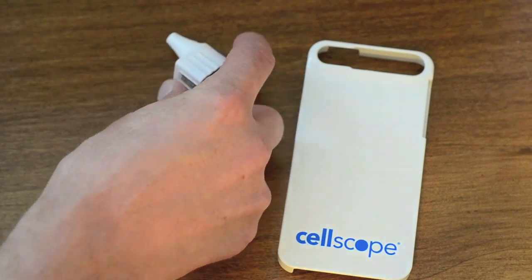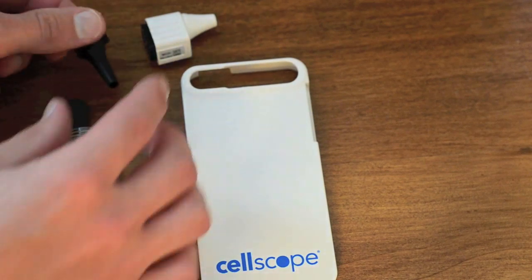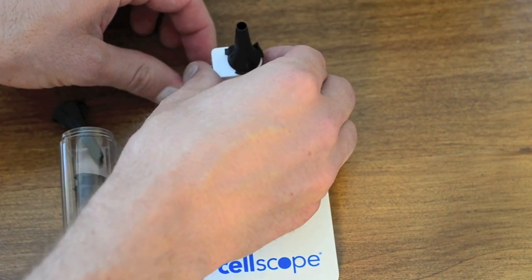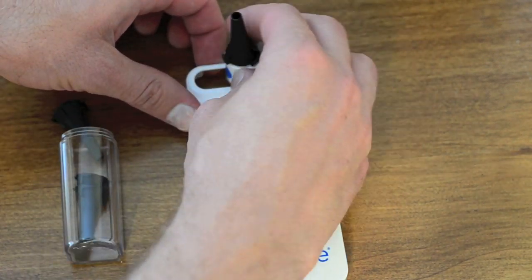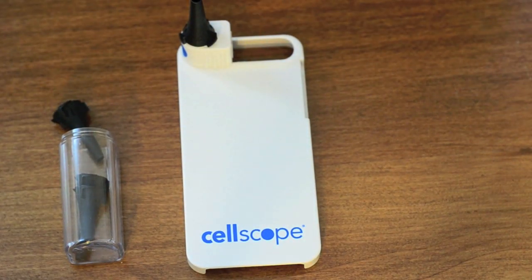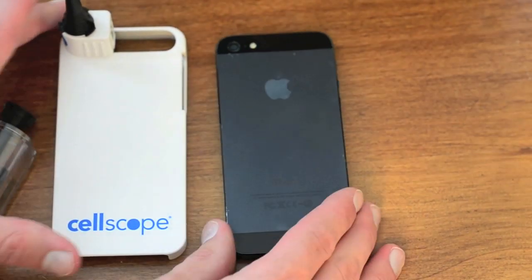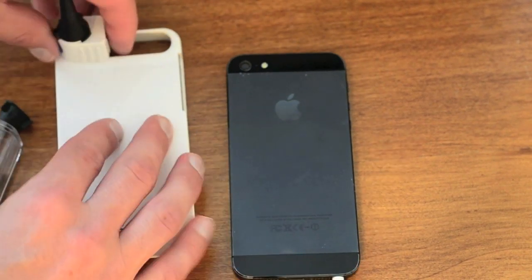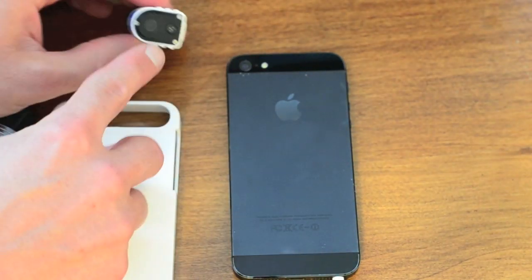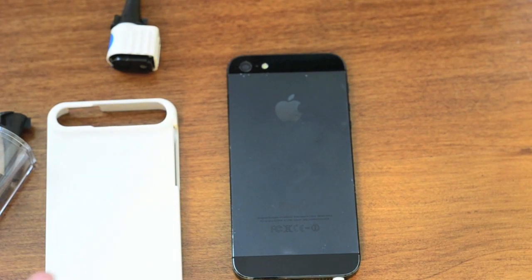You can see it attaches right on. You'll put on the cap and then slide it on like this. It uses the phone's camera flash as the light source — you can see the camera flash will light up the back of this with some kind of optic fiber. Let's take a look at how it actually works by sticking it in my ear.